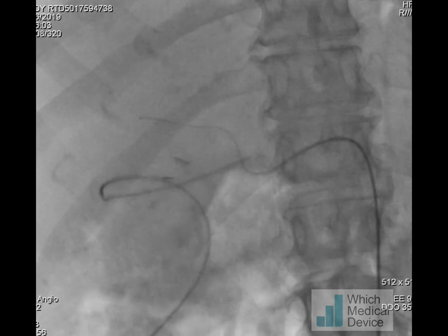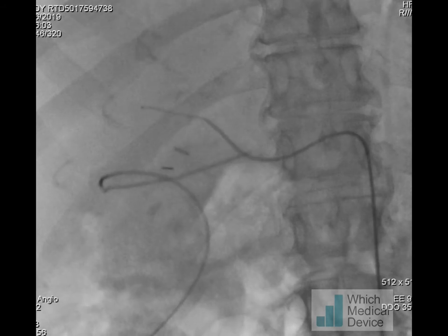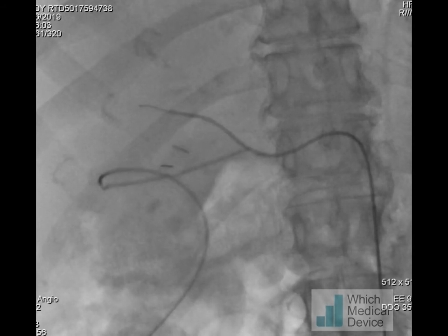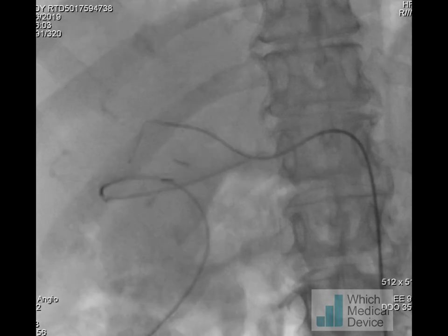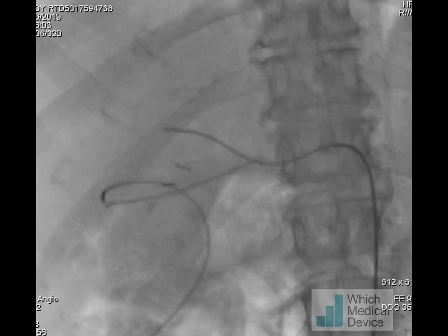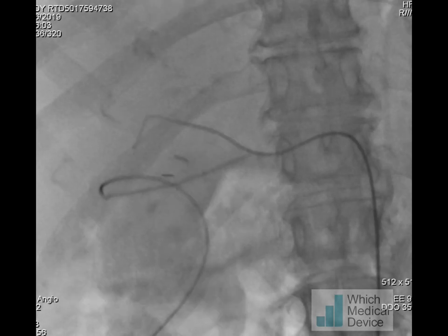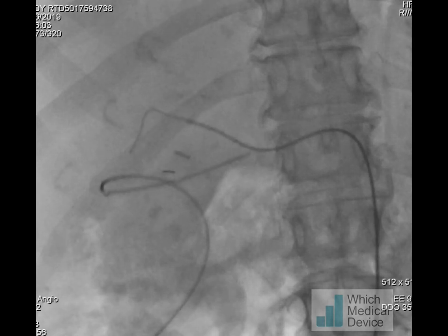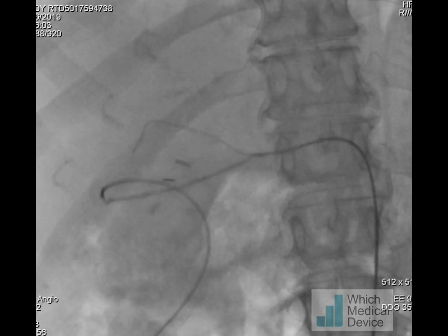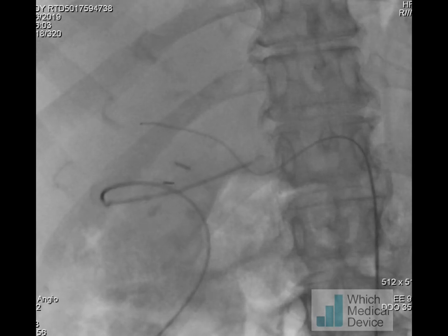First of all I've placed the Benson wire in the right hepatic artery. I'm advancing the SIM2 along the right hepatic artery, but at the moment this is as far as I can get, which is probably not far enough to give me good secure access. I've changed for a stiff Amplatz guidewire with a short floppy tip, and this is going to allow me to insert a 5 French destination sheath which will give good support for placement of a stent.